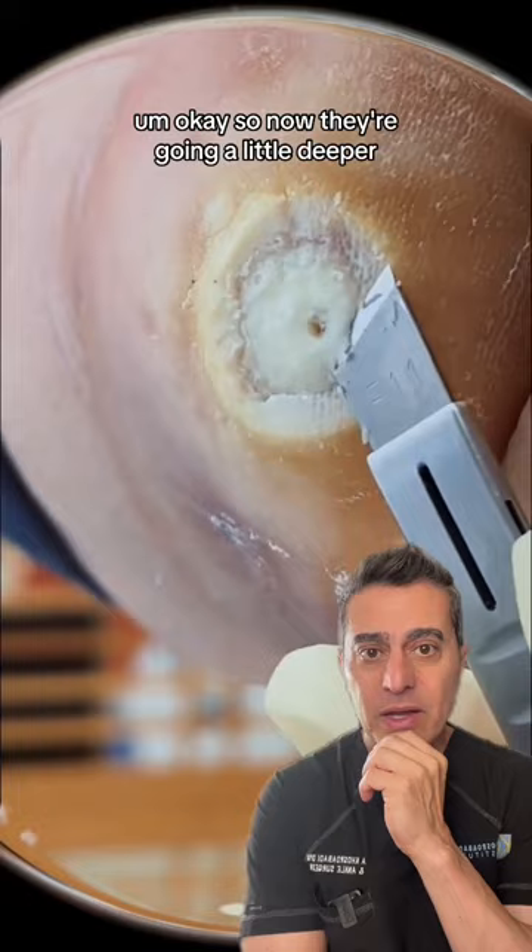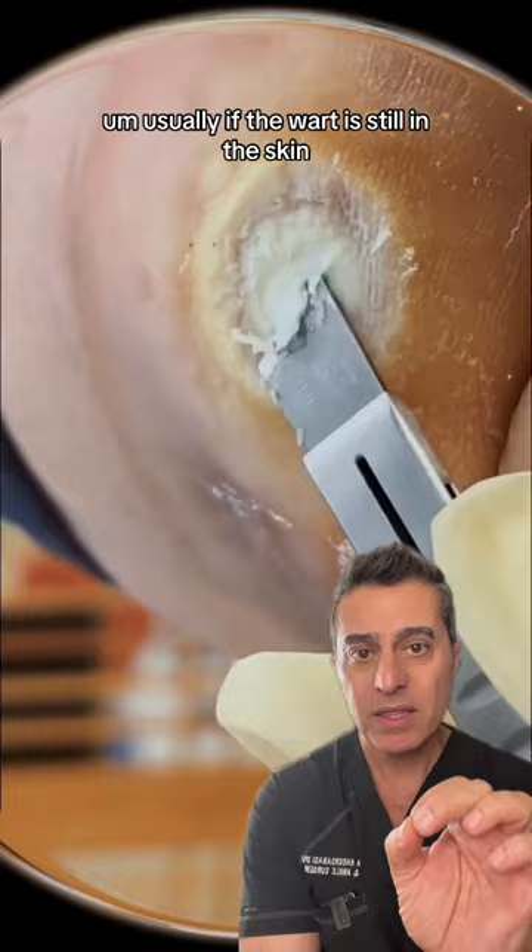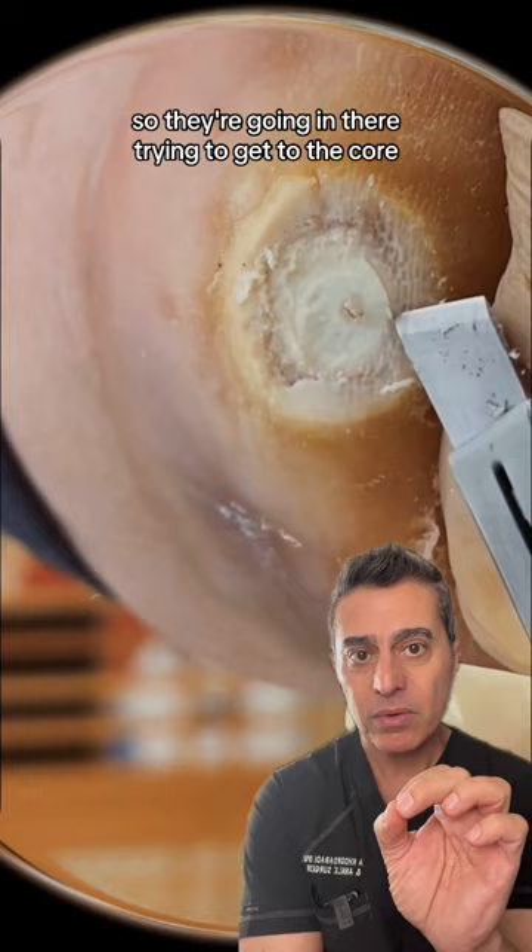Okay, so now they're going a little deeper. Usually if the wart is still in the skin, you will see pinpoint bleeding, so they haven't gotten there yet. So they're going in there trying to get to the core.